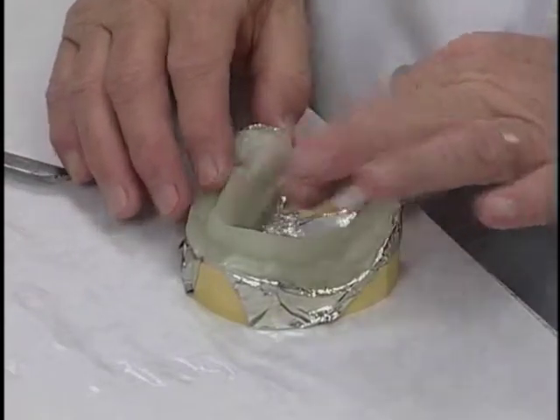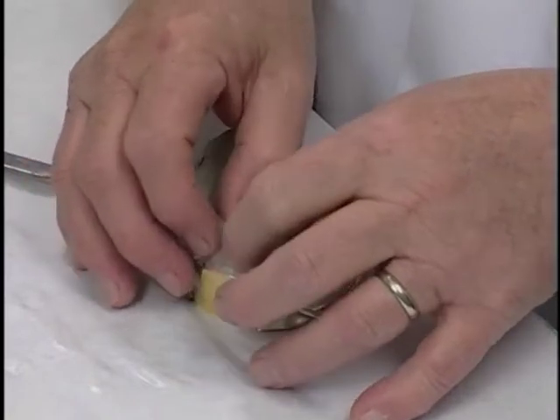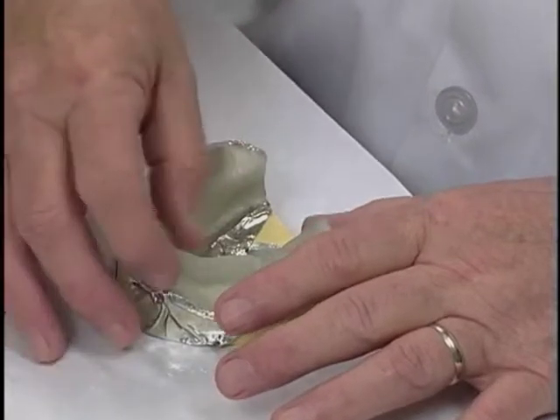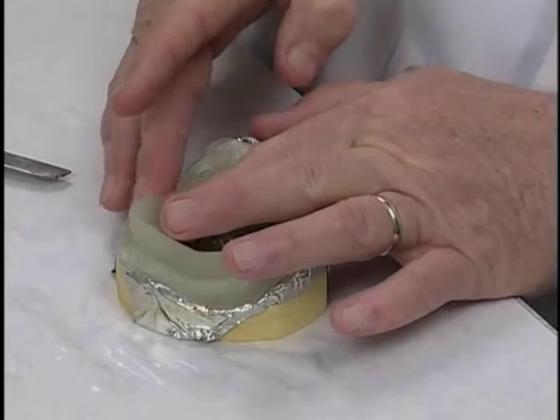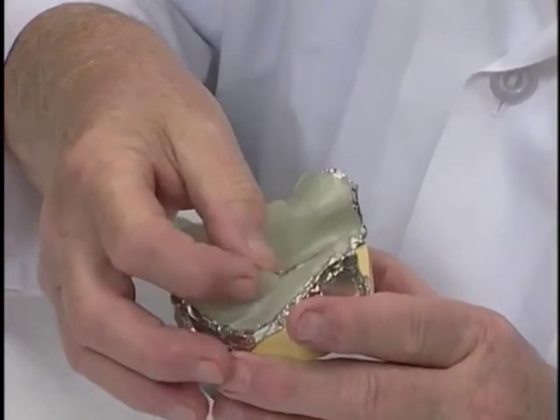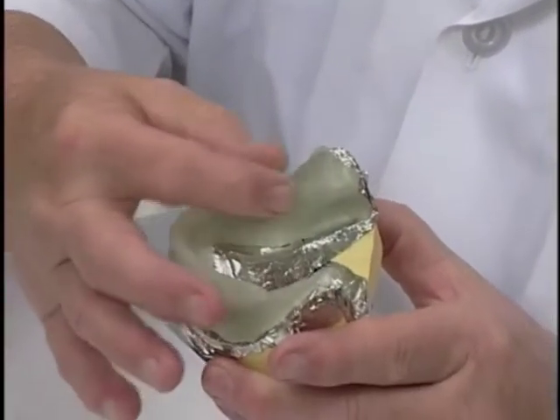And now we're going to shape that handle in two ways. In the anterior portion, I want to build that up enough so that when I get a hold of it like that, I can hold that without it slipping out of my fingers. Posteriorly, what we want to do with that, we would like to keep the surface of this parallel to the crest of the ridge if at all possible. It looks a little low posteriorly, so we just build that up a little bit by squeezing it like that.